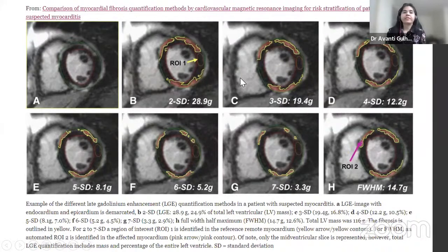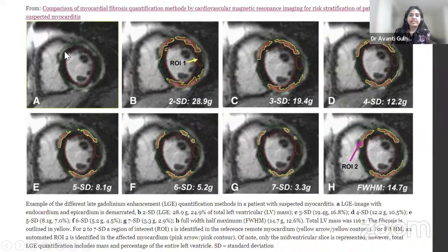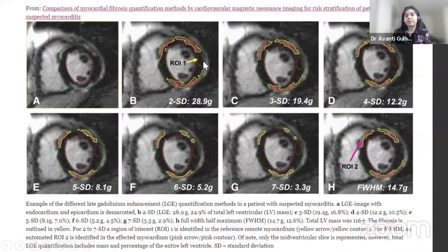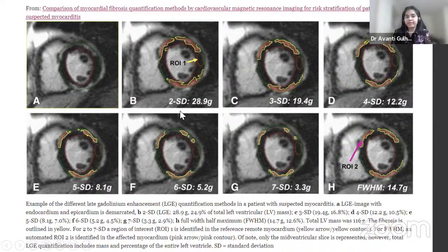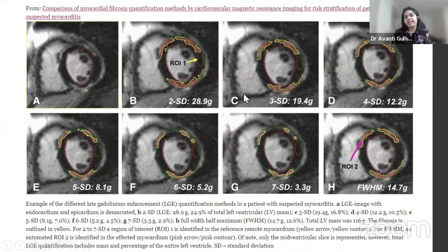The image shows a faint subepicardial scar in the anterior anteroseptum, anterolateral segment, inferior, and inferoseptal segments. For the standard deviation techniques, the ROI is placed in remote non-enhanced normal myocardium — the lateral wall in this patient. For full width at half maximum, the ROI is placed in the enhanced fibrosis region. The amount of fibrosis is highest with 2 standard deviations, significantly higher than 3 standard deviations or full width at half maximum. These three methods show higher scar than 4 SD, declining further at 5, 6, and 7 SD.